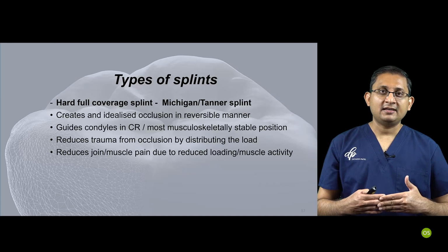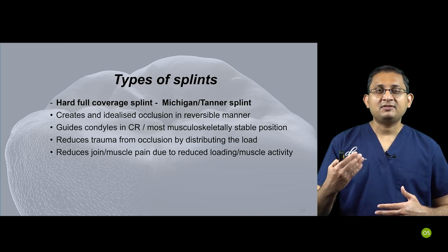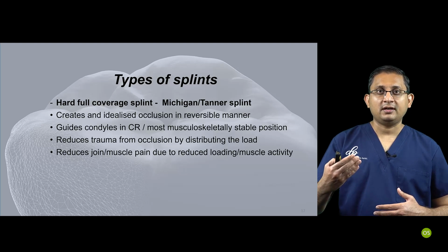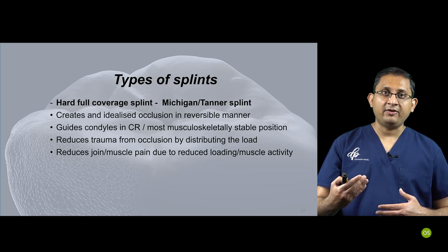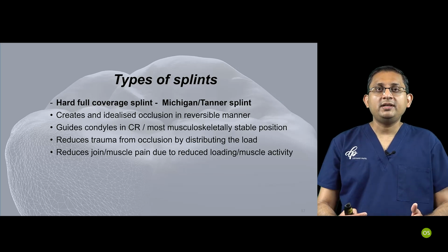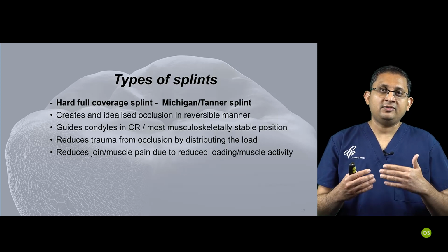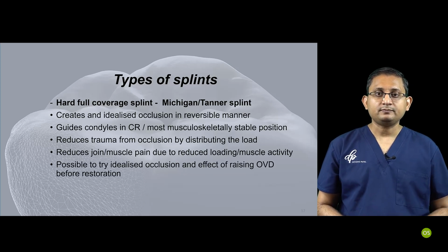And we know that if you have 100% of the force at the posterior molar, you have around 60% of the force at the cuspid area, and around 20% in the incisor area. So I'm moving the force away from the muscles and reducing the muscle activity.